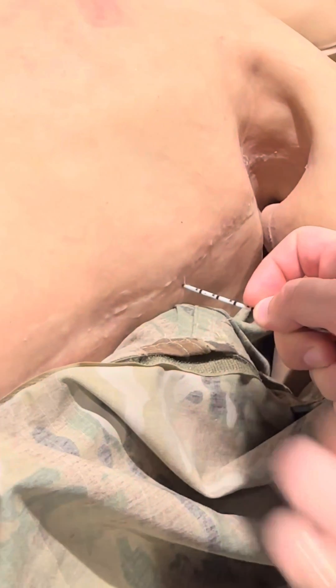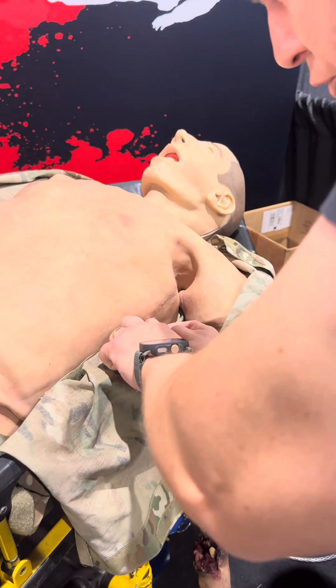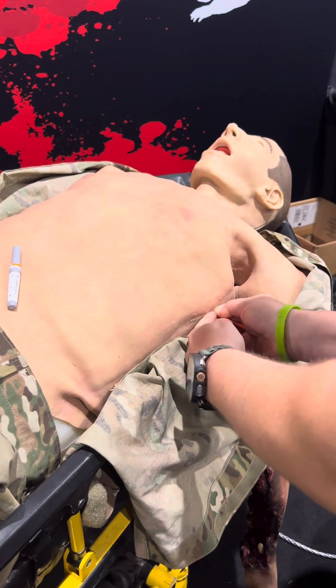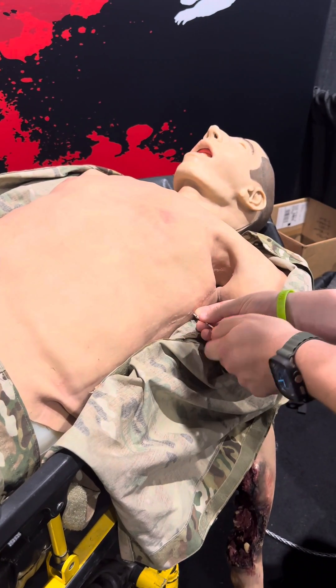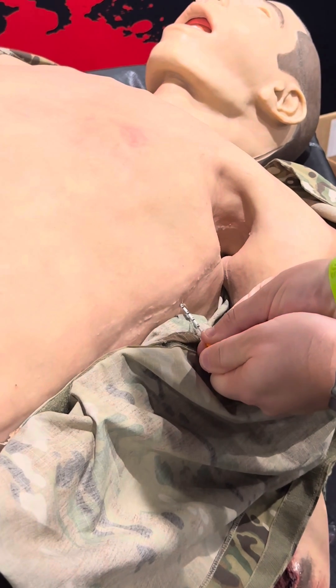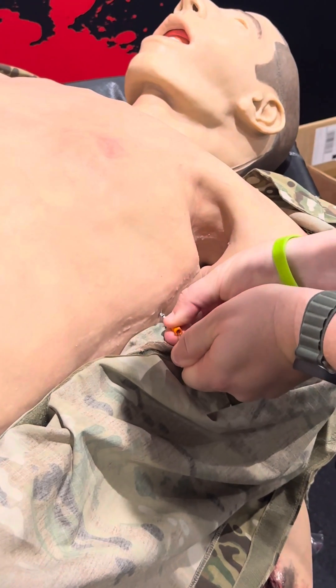If you come in closer, you'll see — I go one, two, three. I keep my finger here. I'm not going to bend this angle towards the clavicle. I now reach my finger here — that's my marking. And now I'm going to use this, hold it steady, and advance this catheter all the way in.